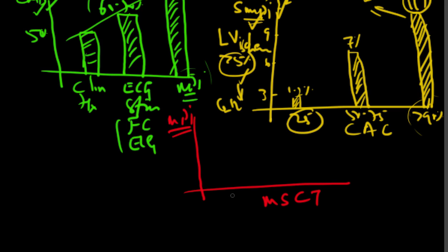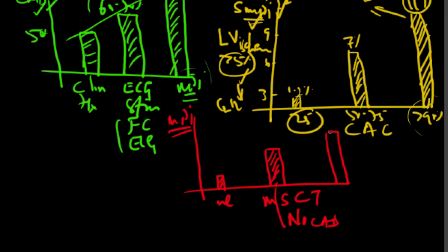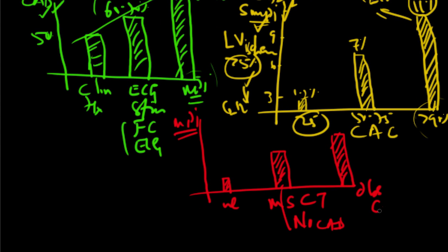So let's understand that. Patients who have, say, a normal, so there is a small group which has a totally normal multi-slice CT. There is another group which has a non-obstructive pattern, if you will, and these are non-obstructive varieties, so I call them NOCAD, non-obstructive CAD. And then there's another group showing obstructive CAD, as obtained by multi-slice CT or CTA, if you will. This is a CTA study. I'm sure you're familiar with that.